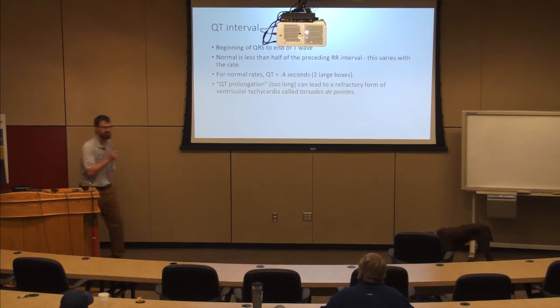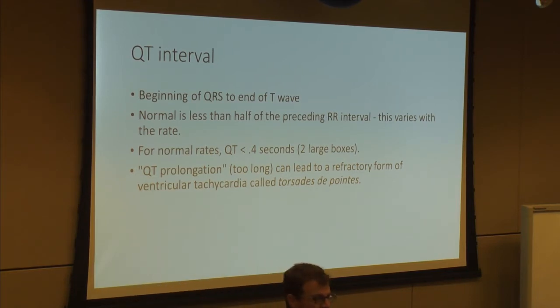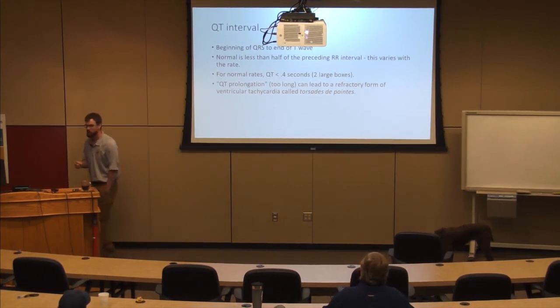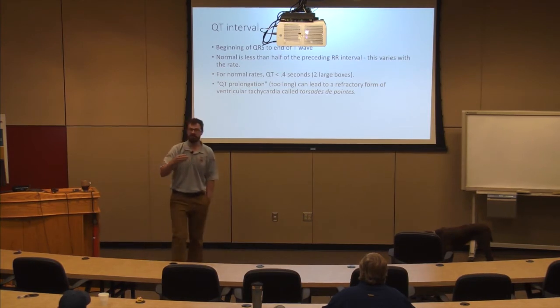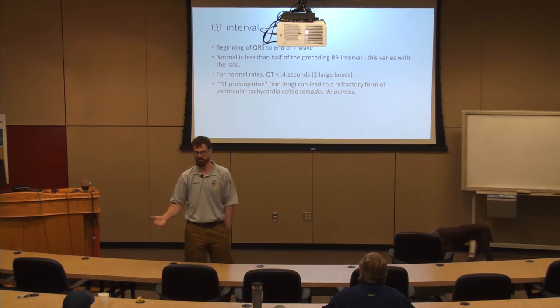The implications are different. What happens to wide QRS in the setting of sodium channel toxicity? Monomorphic tachycardias, okay? Monomorphic VTach. By and large, they'll precipitate into VTach. We can anticipate that and treat it with sodium bicarb. QT prolongation is a sign of impending torsades, which we typically treat with magnesium, okay?